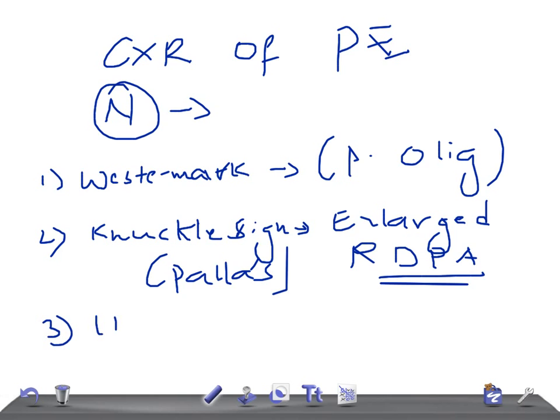Very important: Hampton's hump. Hampton's hump is a peripheral wedge-shaped opacity with convexity towards the hilum.